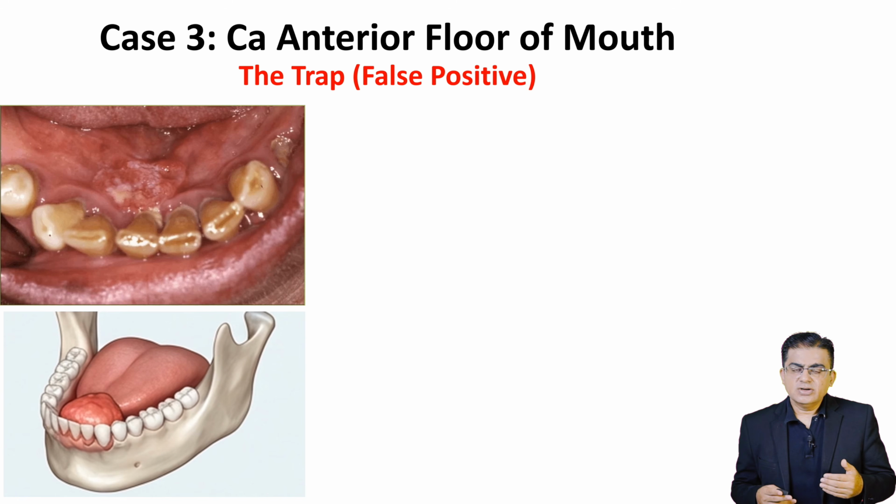The clinical question is again the same. Is the bone involved or is it just an abutment? Essentially, we want to know, should we just shave the bone or do we cut it? Do we do a marginal mandibulectomy or a segmental mandibulectomy?